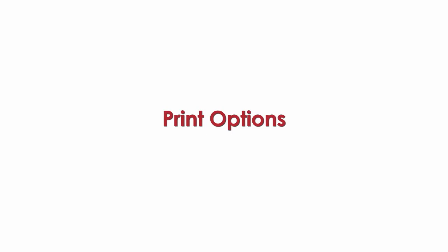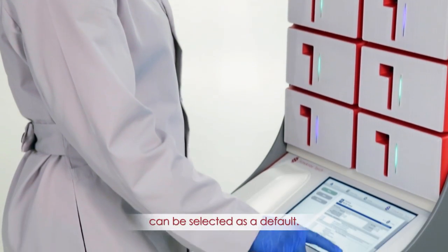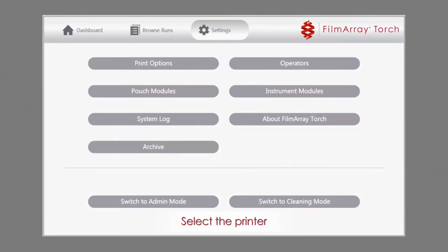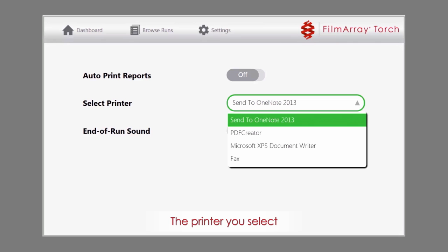Print options. Any printer that has been configured to the FilmArray Torch can be selected as a default. Select the printer in the Select Printer drop-down menu. The printer you select will be set as the default for the FilmArray Torch.